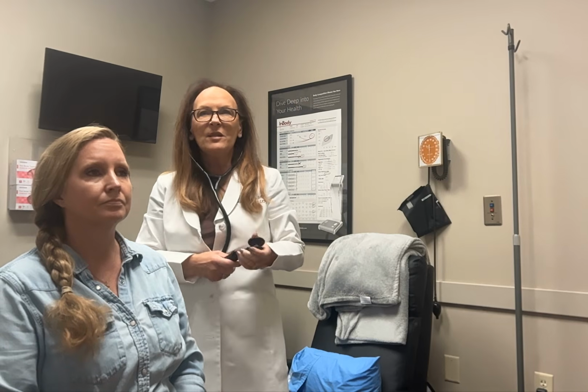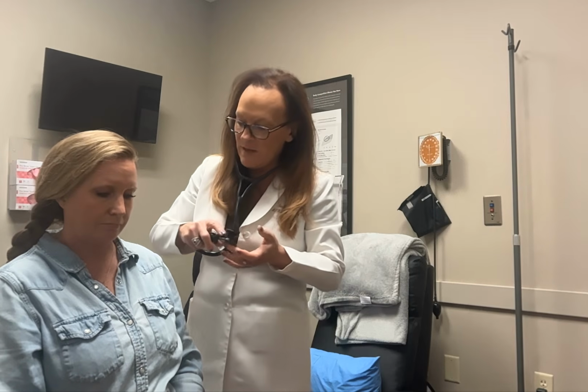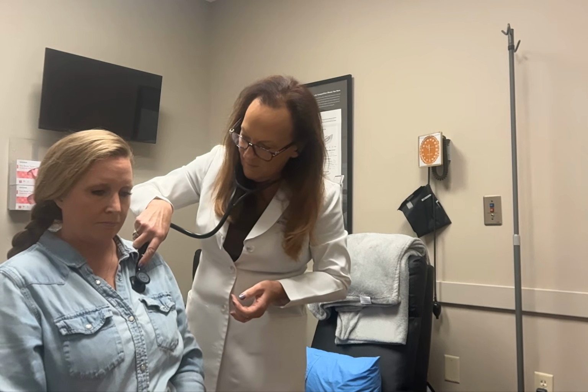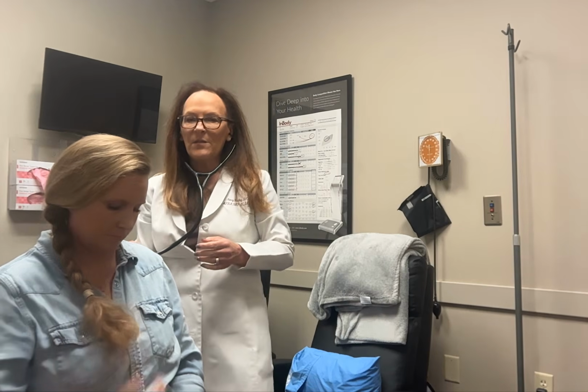Next, I'm going to auscultate the anterior chest for lung sounds, beginning in the intercostal spaces, and make sure that the breath sounds are clear bilaterally. Good deep breath. Again. All right. Intercostal spaces are clear, both sides.